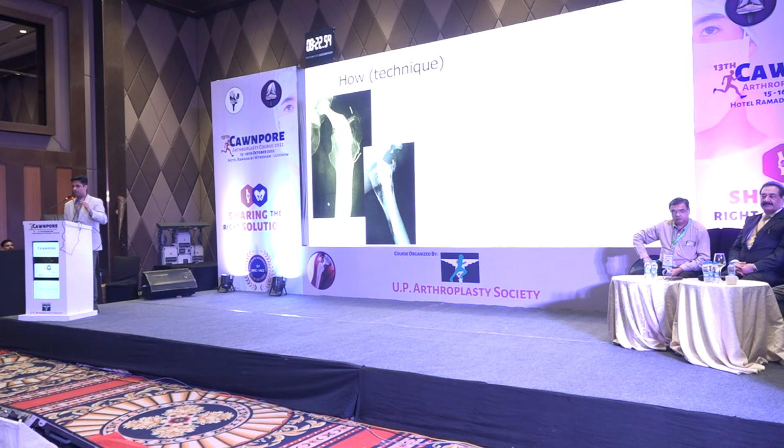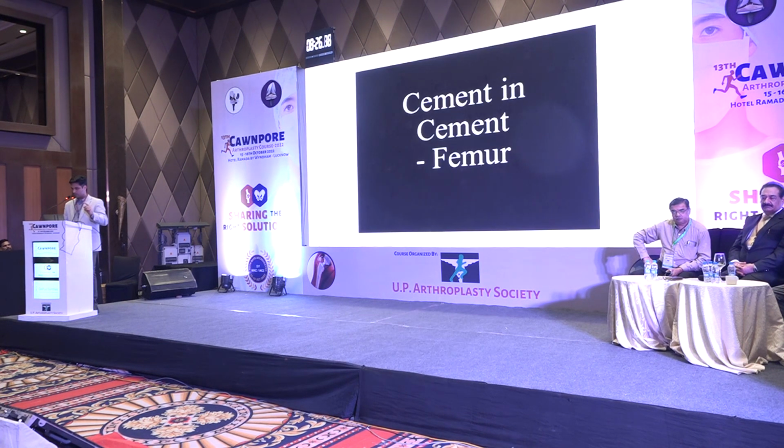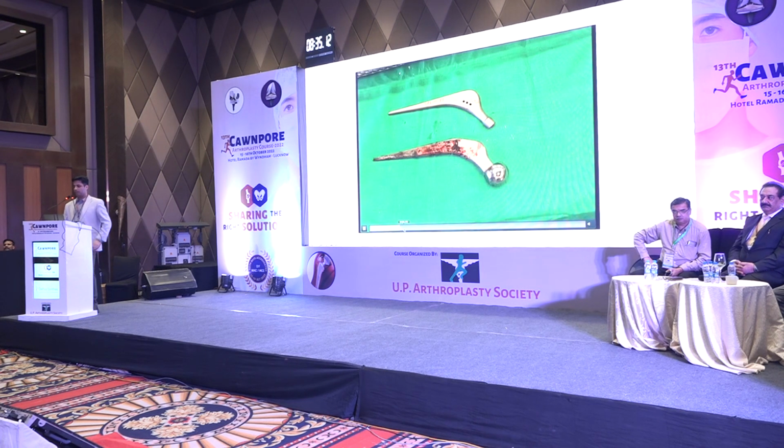I'll just show you the video here. So after you've done this and you reached here, I'm going to skip again because some part of it is not so important. Let's start out here. So the prosthesis comes out and you want to put the smaller one there.